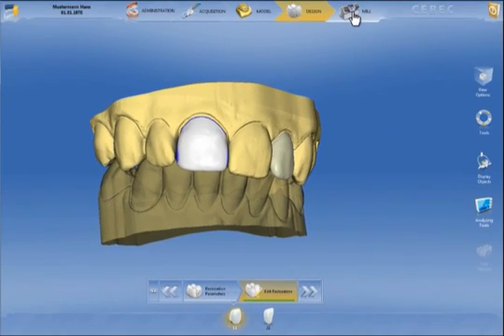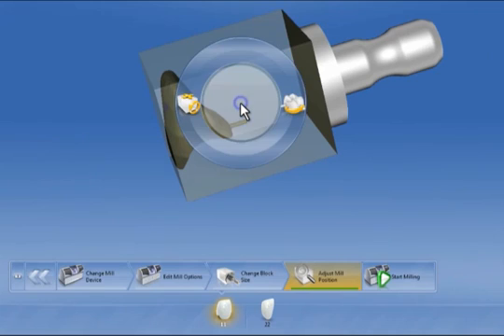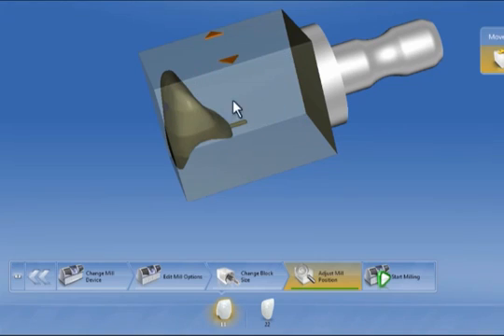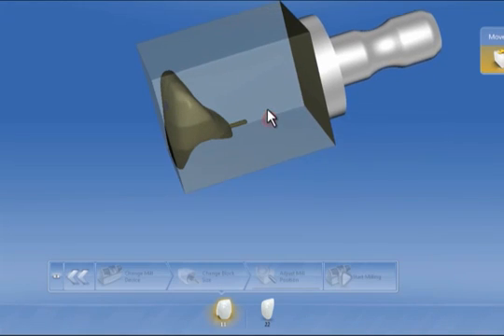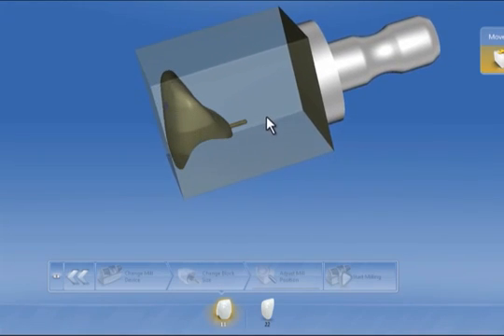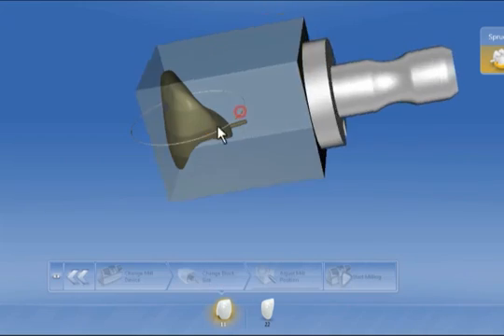Following design comes the mill phase. In mill, we can also use the tool wheel to change the position of the restoration in the block, such as to influence coloring or the position of the sprue.